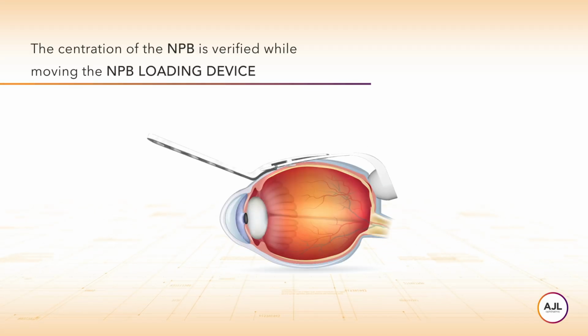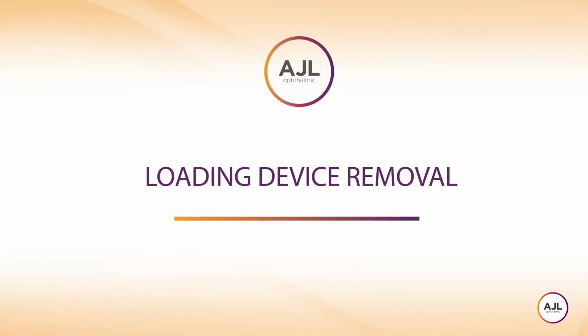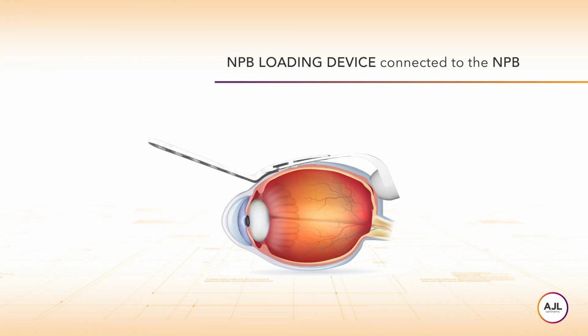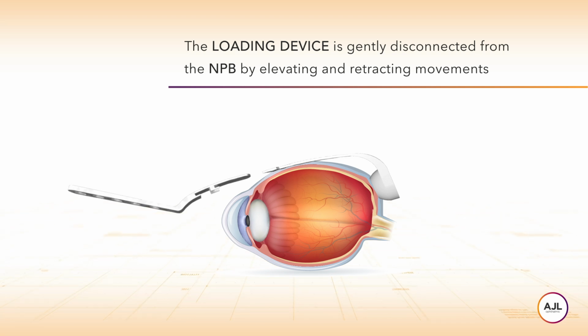The centration of the NPB is verified while moving the NPB loading device. The NPB loading device is connected to the NPB. The loading device is gently disconnected from the NPB by elevating and retracting movements.